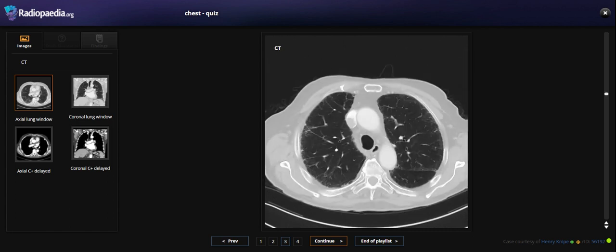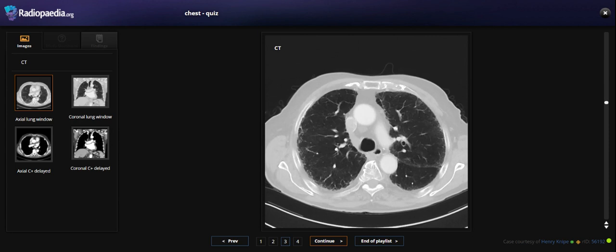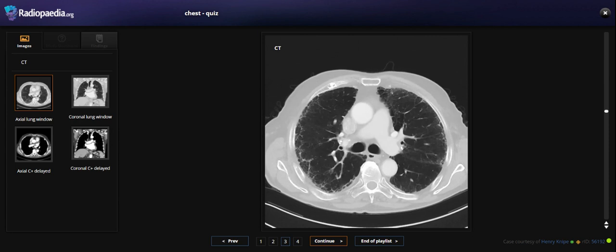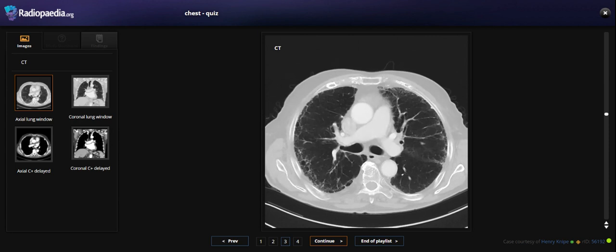So this is what we see: minimal, subtle changes — including air trapping, small airway disease, and bronchitis.